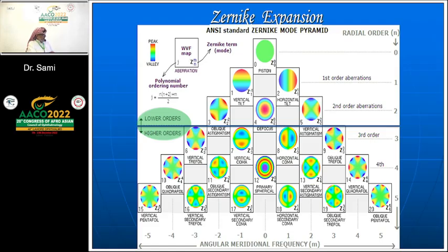If you look here, it's number 4 because they have 4. Number 3 because they have 3: 1, 2, 3; 1, 2, 3. And then here, number 4: 1, 2, 3, 4; 1, 2, 3, 4. So the lines are now 2, 3, 4. It is the number of aberrations. And then in the middle is the spherical aberration.